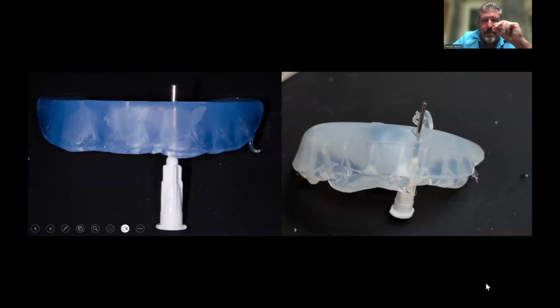And then I'm going to poke holes in this. The way I do it is I go from the inside out. The reason is this: it's going to break sometimes, and if you do it from the outside in, you're going to break what you wanted to build up. Additionally, I will make this hole and then I will take a KS2 burr diamond and drill it out a bit more, just the size for a heated packable composite capsule to fit into.